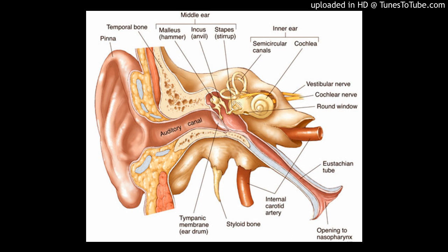However, there is a trade-off, since the functional impact of canal wall removal is also important. The removal of the ear canal wall results in a space, the mastoid cavity, which is less likely than the original ear canal to resist infection. Exposure of the ossicles may allow the subsequent formation of a new cholesteatoma deep to the ossicles. To prevent this, these ossicles must be removed, which may diminish the patient's hearing.